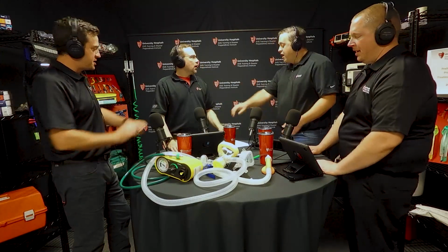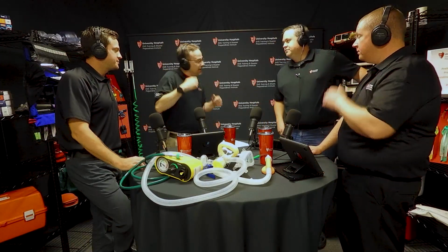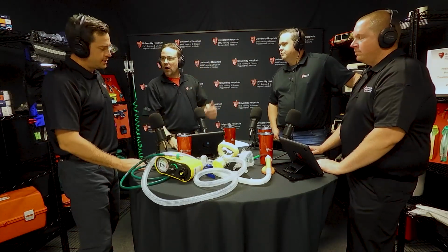If I go up and say, hi, I'm John, I'm a paramedic, what's your name? And you say Scott, I'm like, everything's intact, everything's likely okay. I've got a pulse. Is he fast? Is he slow? ABCs taken care of. To his point, if I don't do it immediately, I'll forget and won't get back to it. The only other time is when we intubate.